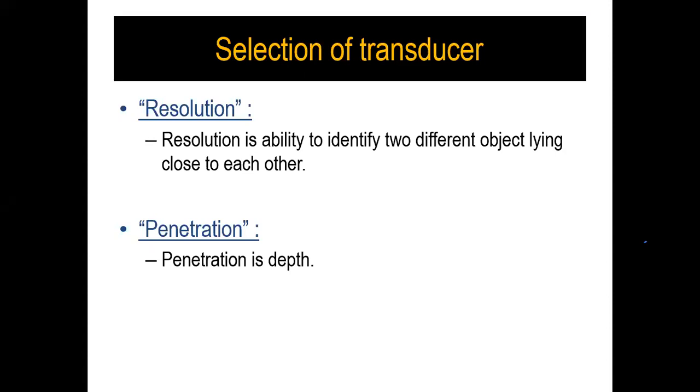When they come closer, they start separating out. When the car is standing right in front of you, you can see the size of the two headlights, the difference between them, and finally their texture. So the resolution of a car standing close by is the highest resolution, versus when the car was far away and the image looked like a blob.